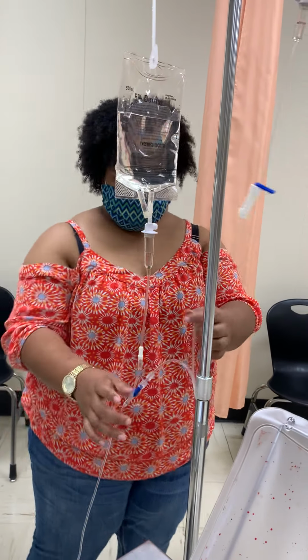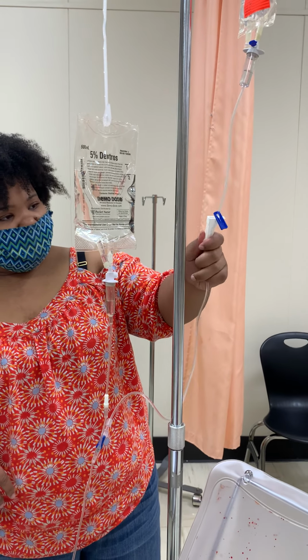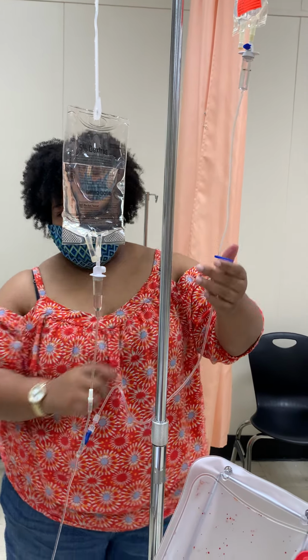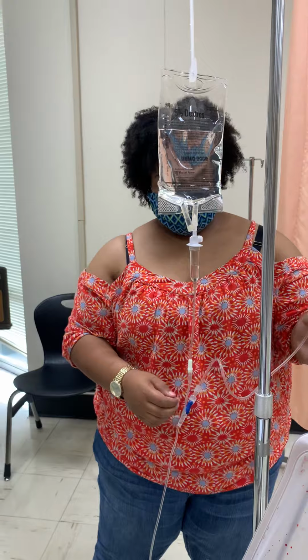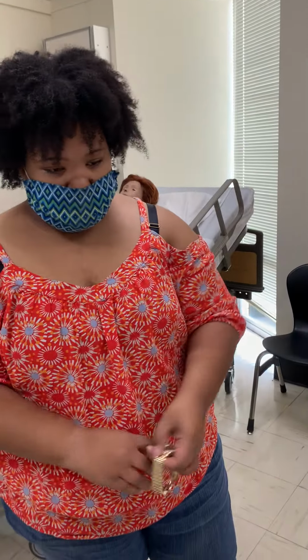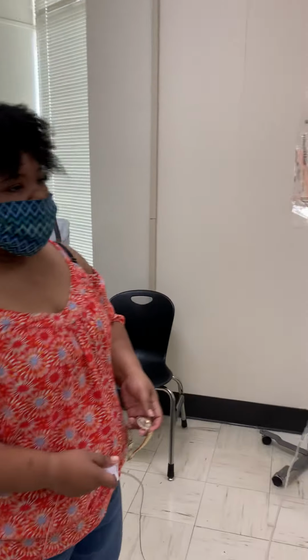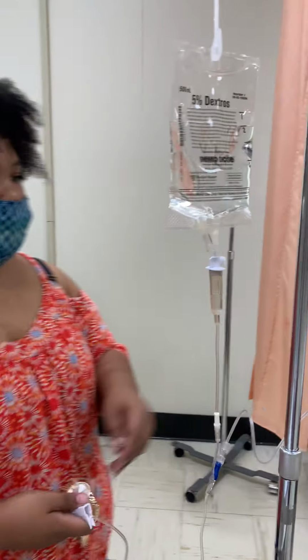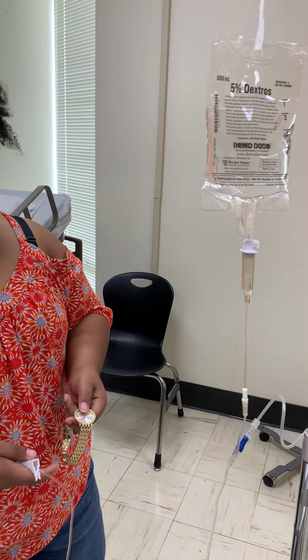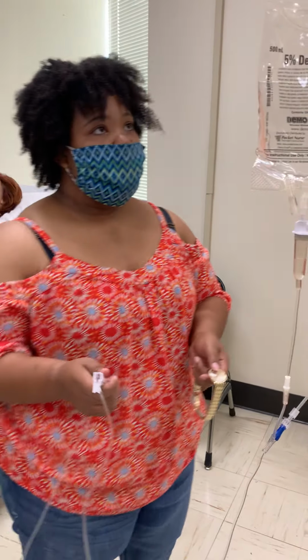All right, so now that I have them connected, I can open up my secondary tubing. And now, since we're doing this by gravity, I need to, okay, so I got this open. Okay. Then I need to start manipulating it with my primary.